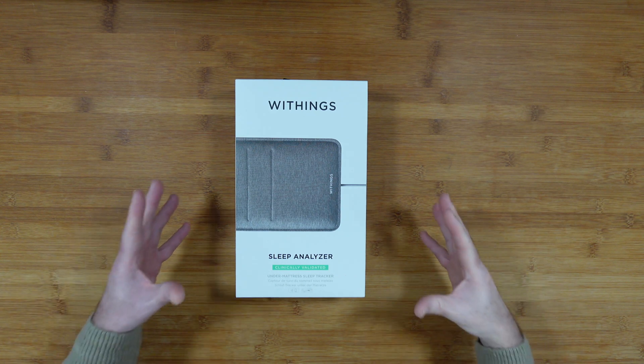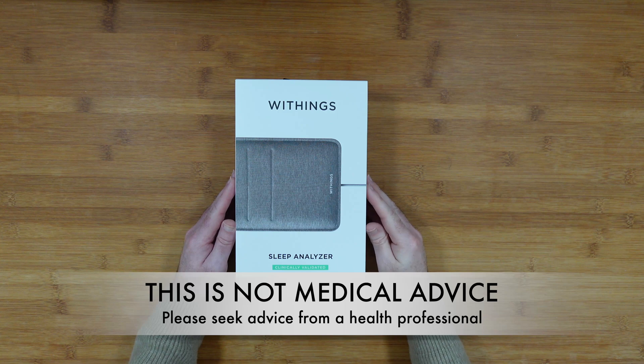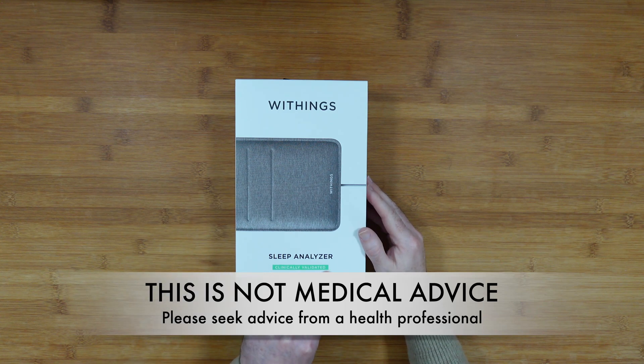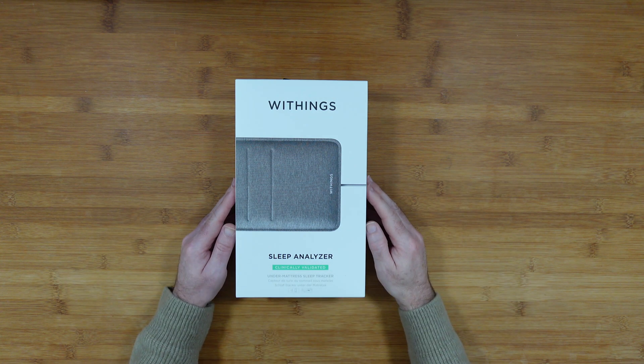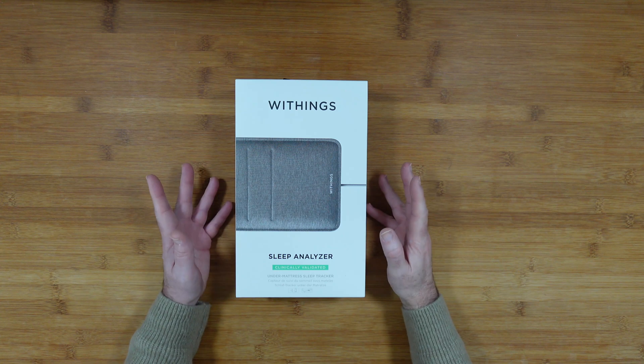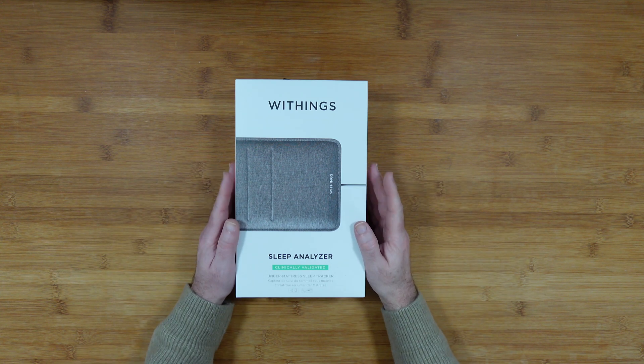Hello, welcome to my unboxing and review of the Withings Sleep Analyzer. This is a clinically validated under-mattress sleep tracker. It was very kindly sent in free of charge by the manufacturer — no money has changed hands and they haven't asked me to say anything in particular. I'm simply sharing this review so you can make an informed buying decision.